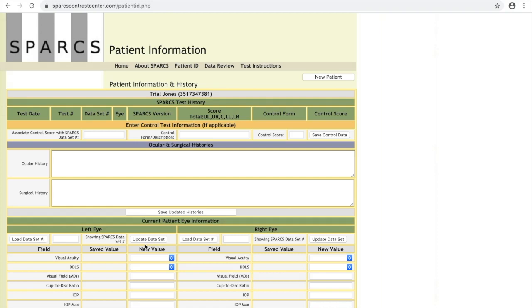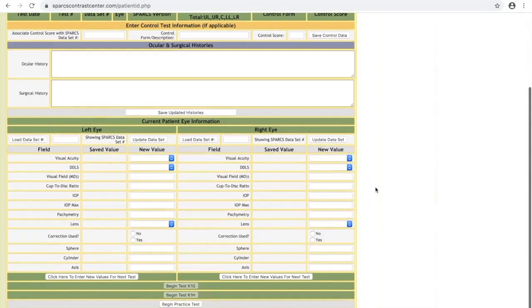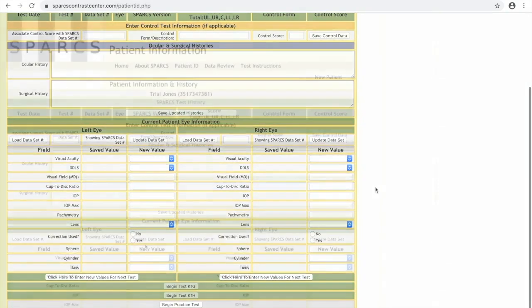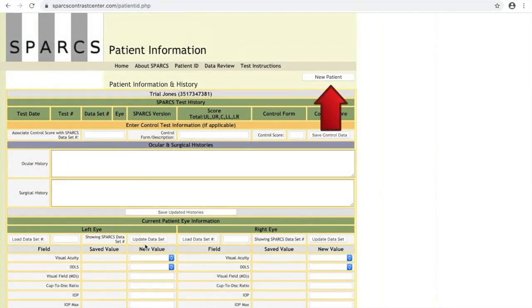This page was originally designed for clinical trials. If you are a clinician not interested in research, what you really need to record is the 10-digit ID number assigned to your patient. If you would like to be able to compare the SPARCS results to other ophthalmic measures, then please fill out the information below and then select 'Click to add new values.' To add additional patients, simply click the button New Patient in the top right.